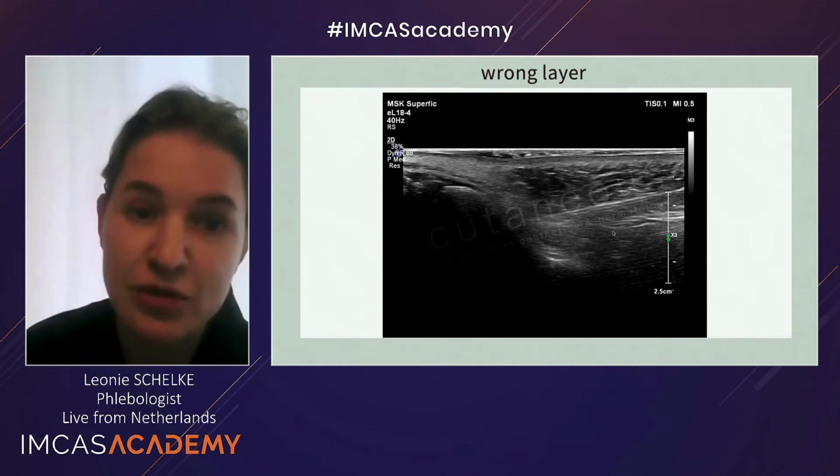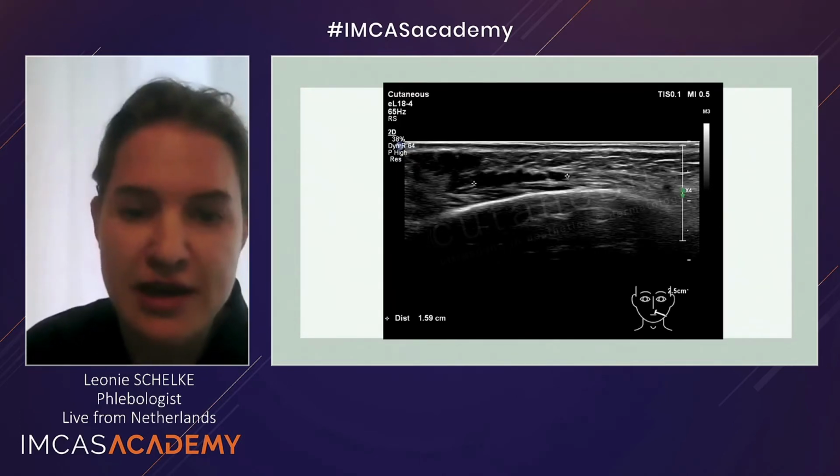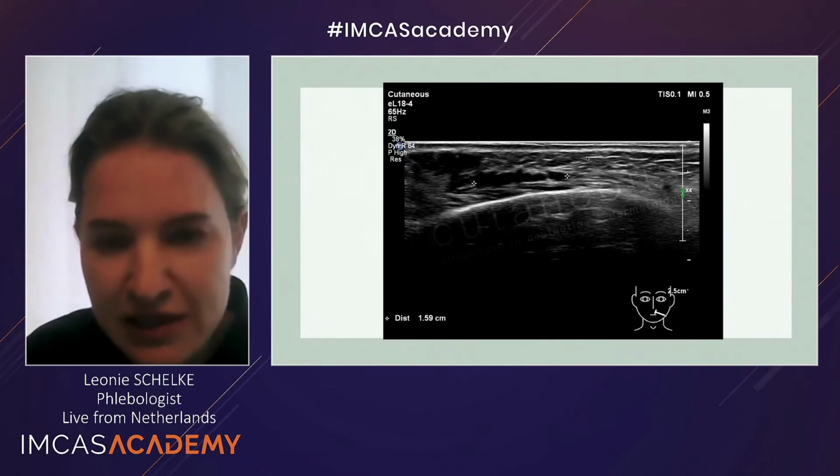People have late onset nodules, and they are caused by filler material, hyaluronic acid, after 3 years injected in the fascia. This is the subcutaneous layer, the dermis and the epidermis. Here is the fascia, and it's injected in the wrong layer.